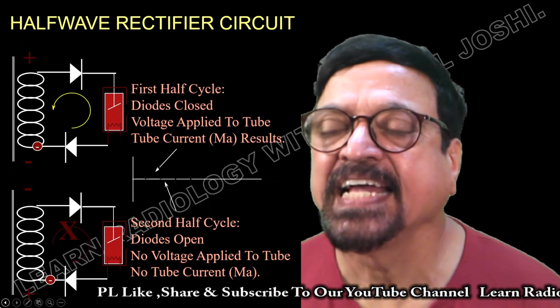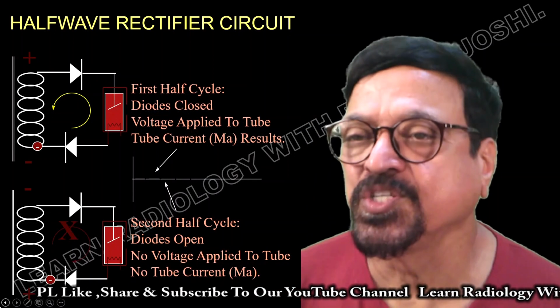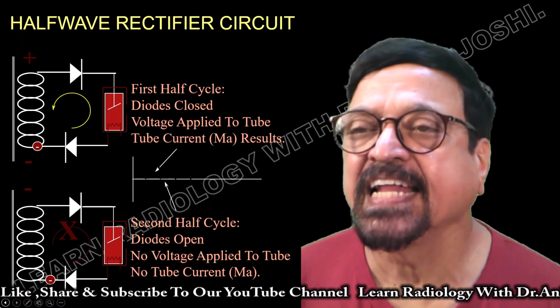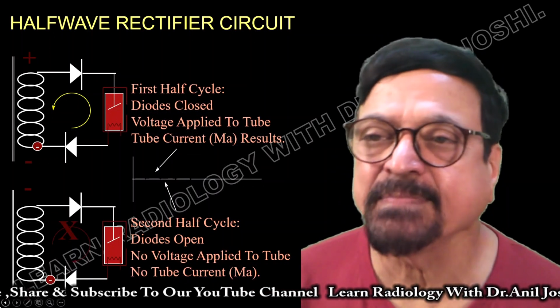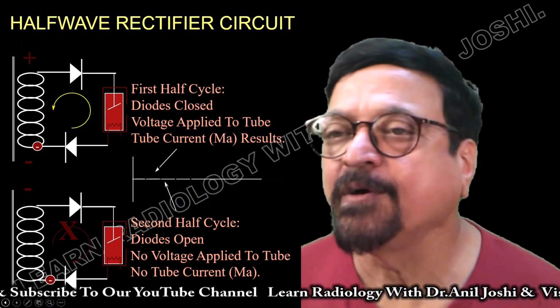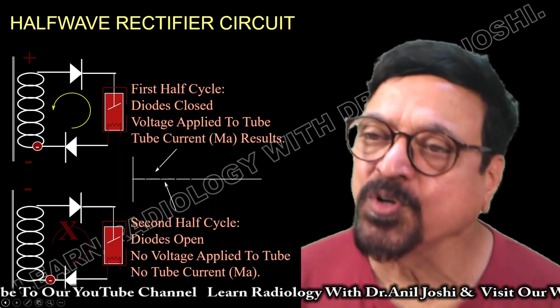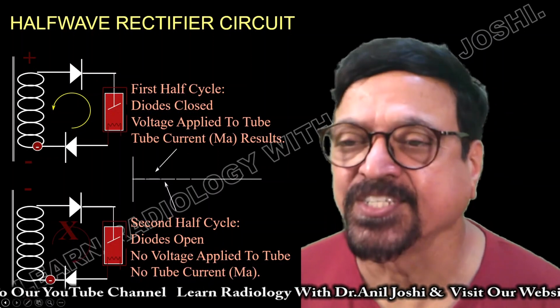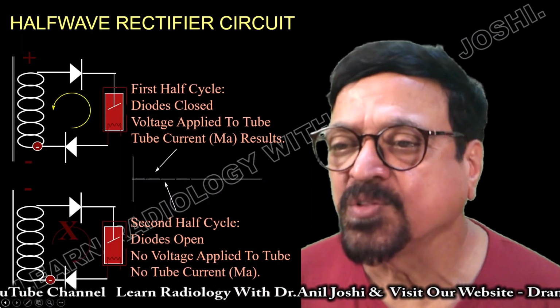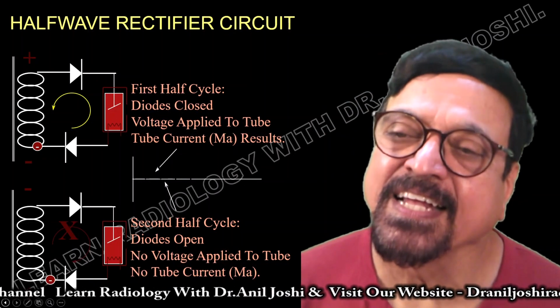Now here we are getting another in detail. Now here we have got two X-ray tubes. See what is happening in the flow of the electricity. Electricity is flowing in the same direction. First half cycle, diode closed, voltage applied to the tube and tube current results. Next, second half cycle, diode opens, no voltage applied, no tube current is there.